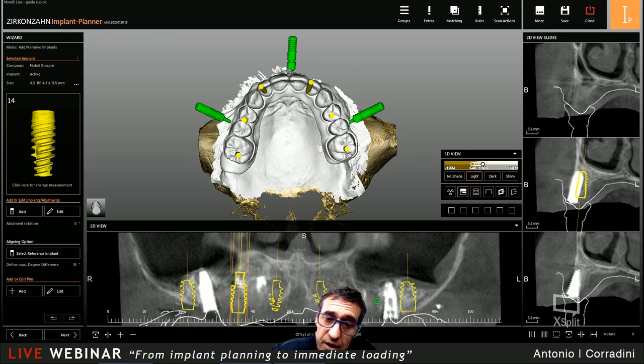And the doctor can understand that they save time, they make their first prototype much more accurate, and starting from the prototype comes the final restoration. They can also save money, because if you have the holes coming out from outside because they didn't check the possibility to make it related to the setup, then they or we have to choose an abutment, an inclined abutment, or a bar or something. So everything becomes much more difficult.